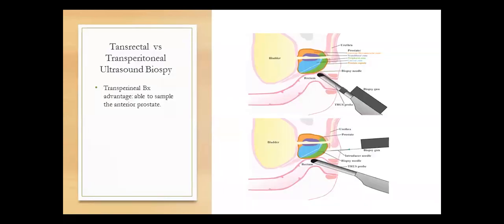So this is just a schematic of the prostatic ultrasound biopsy, a transperineal and a transrectal. The one at the top is the transrectal ultrasound biopsy.